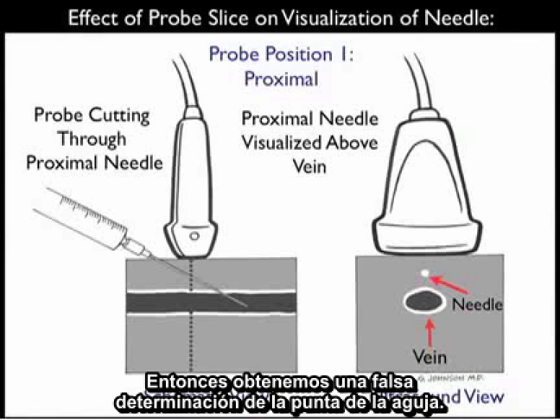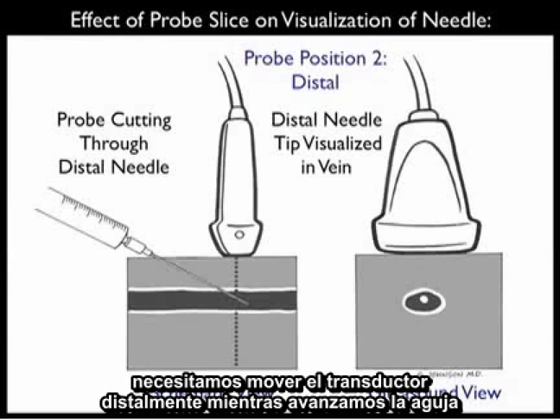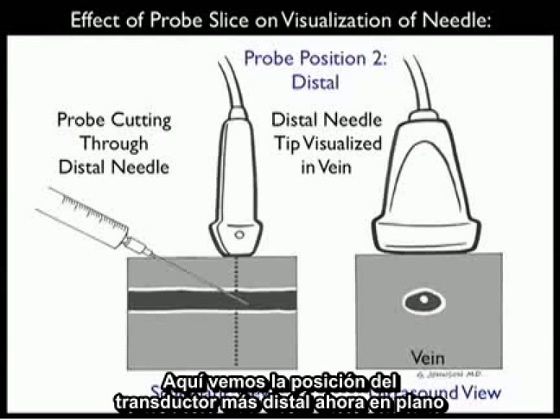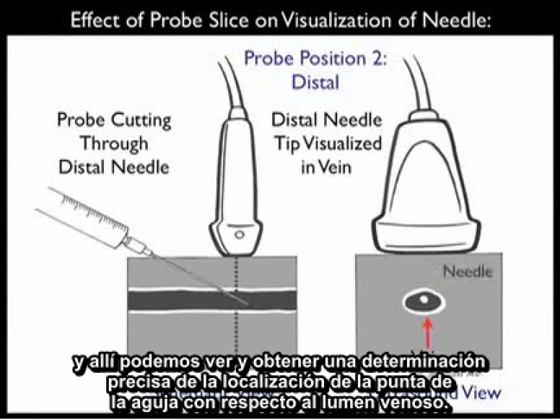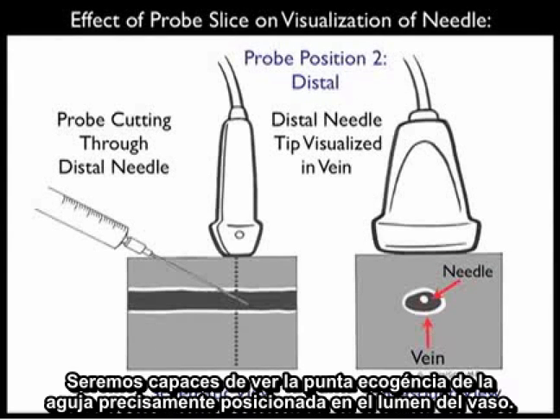So we get a false determination of the tip of the needle. In order to accurately determine the location of the needle tip, we need to move the probe more distally as we advance the needle into the patient's neck along the course of the vessel. Here we see the probe positioned more distally, now in plane with the needle tip in the schematic view. And there we can see an accurate determination of the needle tip location with regard to the venous lumen — the echogenic tip accurately positioned within the vessel lumen.